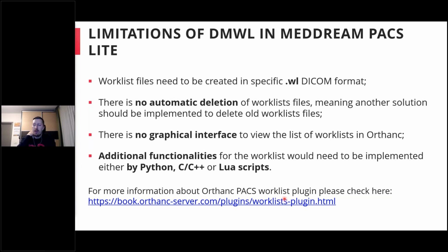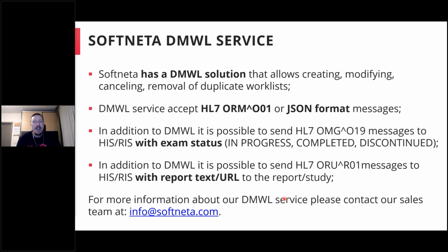And it's 40 minutes. Okay, so just a few more slides about the Softneta DICOM modality worklist service. As I told you about these limitations, which usually matter in the real environment.